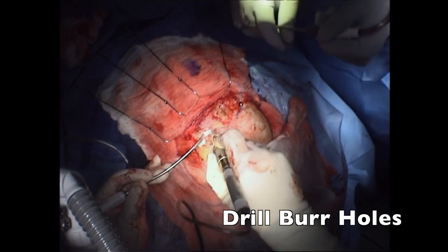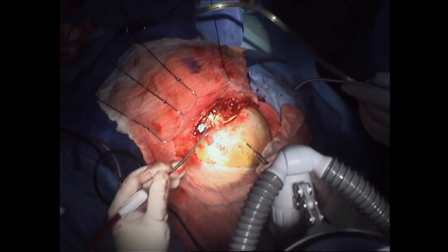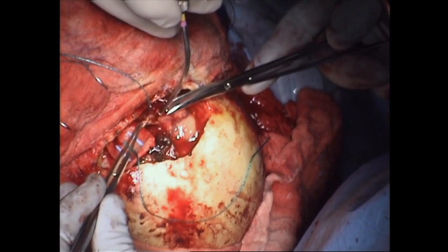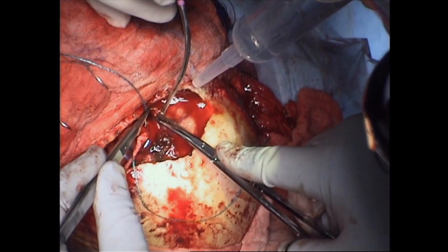Here are some burrholes being carried out as we enter into this area. After the osteotomies have been completed, we raise and remove the bone flap. The dura is then exposed, and we'll incise into it momentarily. Because of all that nodular enhancement crawling up the posterior table of the frontal sinus to its apex, we'll start by removing some of that dura just above that area to remove that portion of the patient's disease.